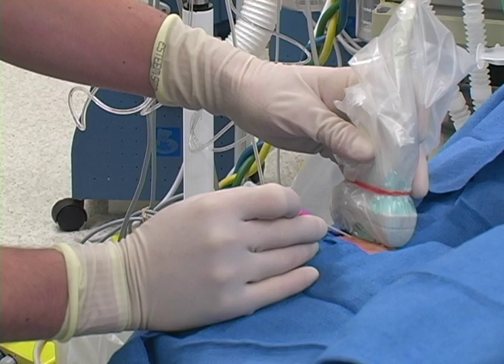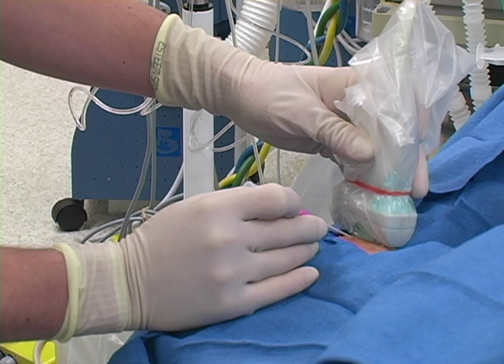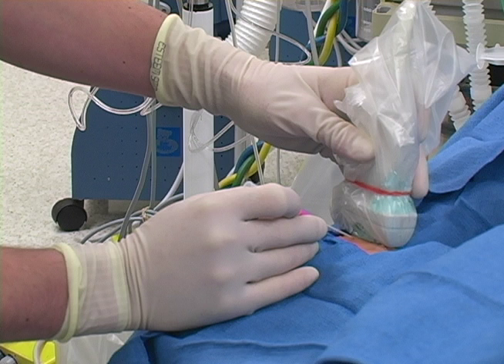The transducer is held in the non-dominant hand, and the needle is held like a pencil in the dominant hand, such that it enters the skin at a 30-degree angle.